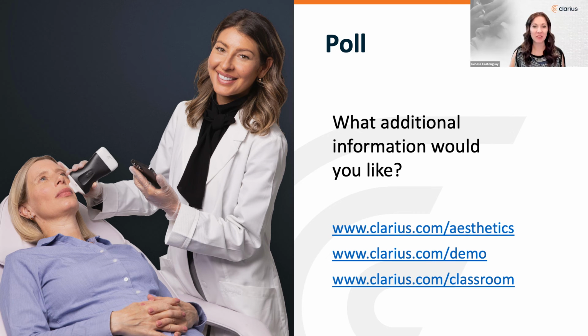Fabulous. We're so excited about that new power fan. Thank you, Dr. MJ, for sharing your best practices for dissolving misplaced fillers so quickly and accurately. And thank you, Shelley, for the fabulous live scanning.